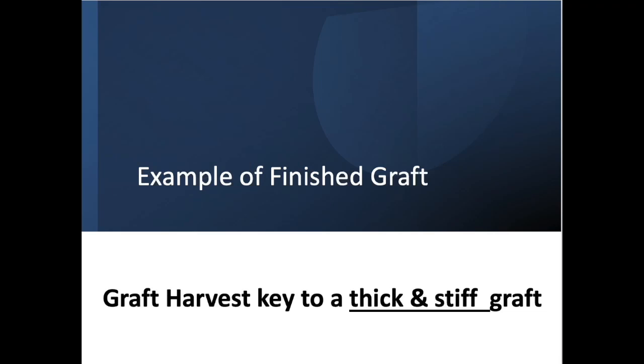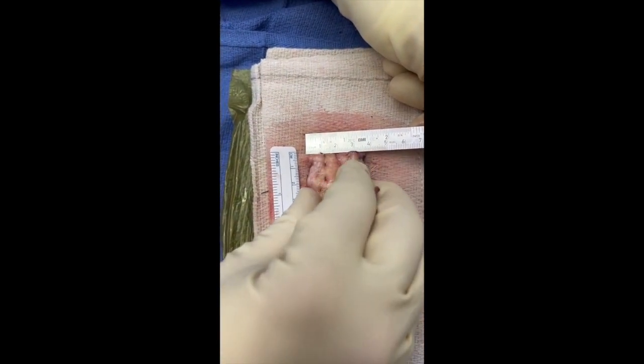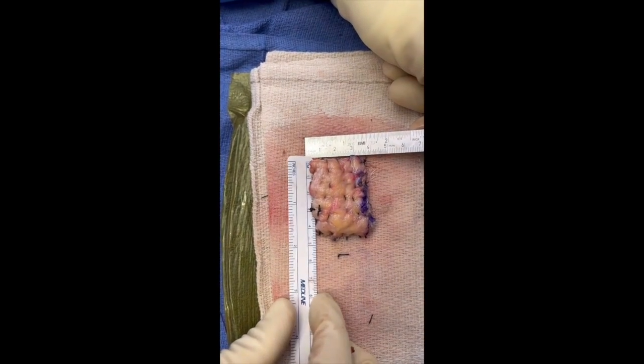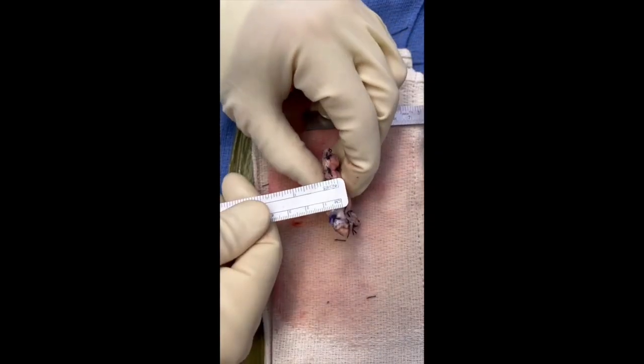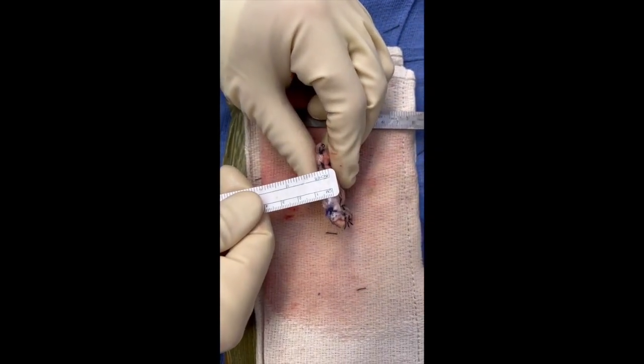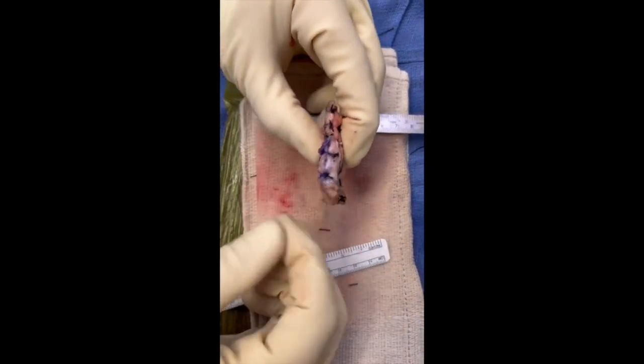Here's an example of a finished graft. We're going to flip it over and show the width, which is about seven or eight. And now we're going to show the stiffness.